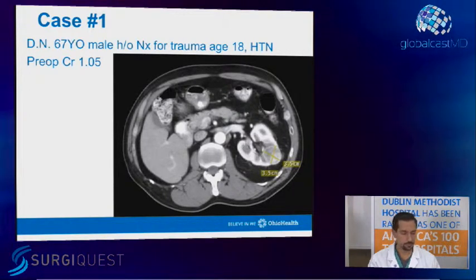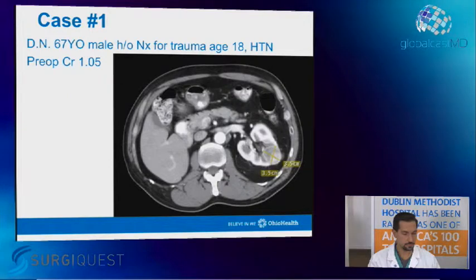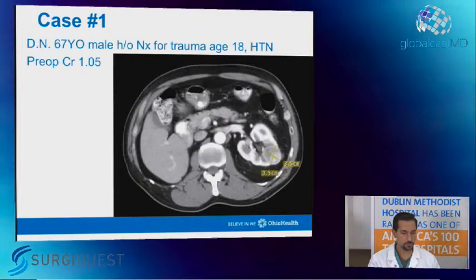So this is still a cancer operation first and foremost. We've got to make sure we can see. This tumor is not in a good location for selective clamping either. It's going to get contributions from both the anterior and posterior branch of the renal artery. So in my hands, I would approach this planning to do complete ischemia and be efficient.